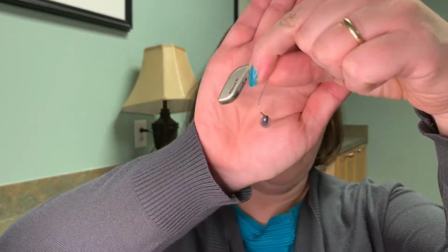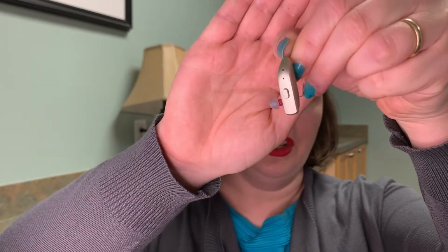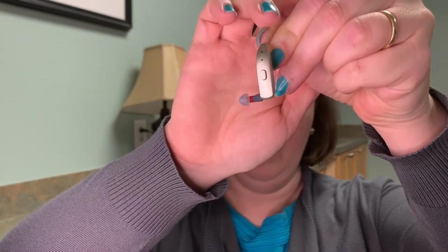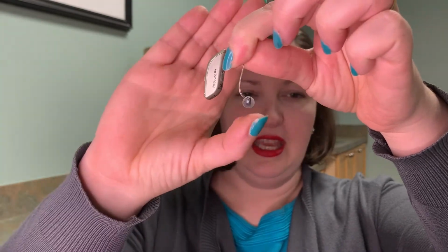The hearing aids themselves have a tremendous change from previous generations in that there are not just two microphones on top, 1, 2, but there's an additional microphone that sits in the ear. Now when this device sits on top of my ear, we add a microphone in the ear canal.